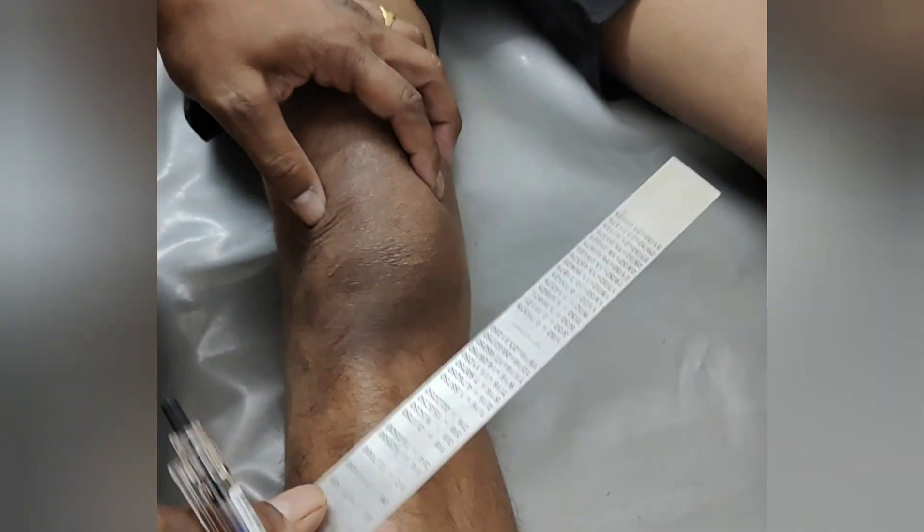Hello friends, today I am going to demonstrate knee aspiration technique.